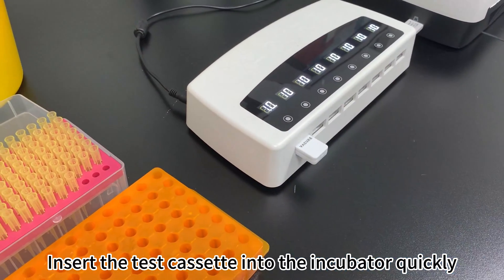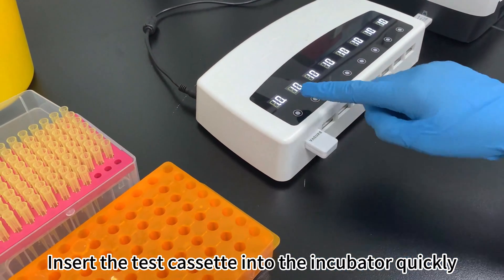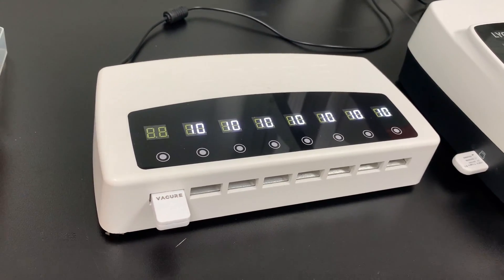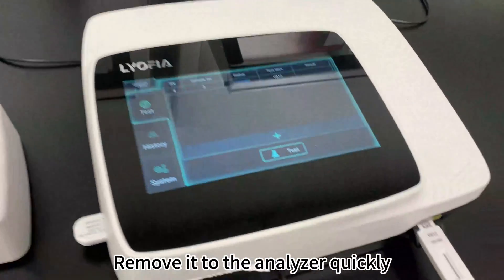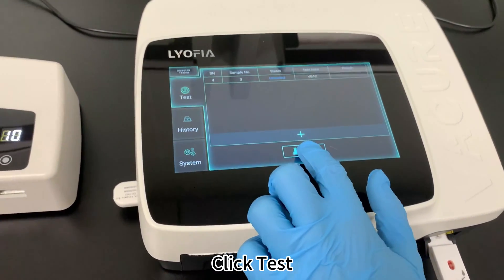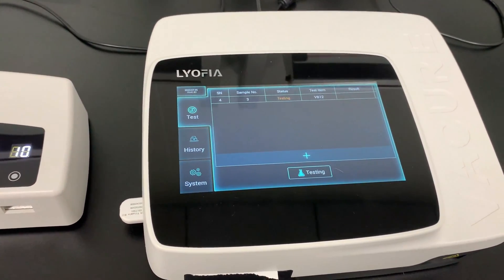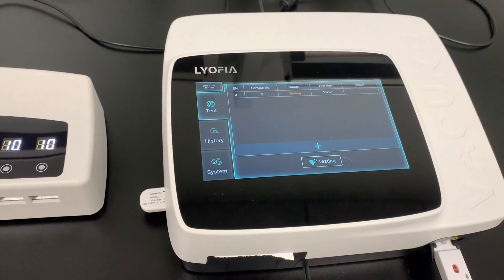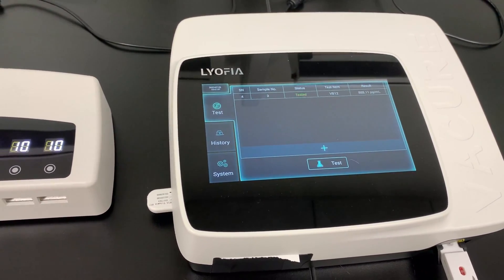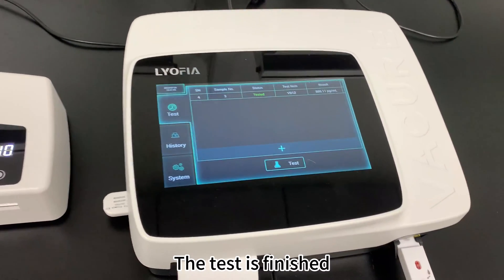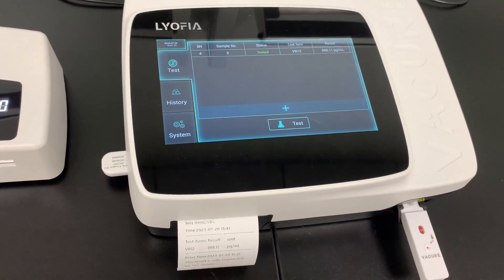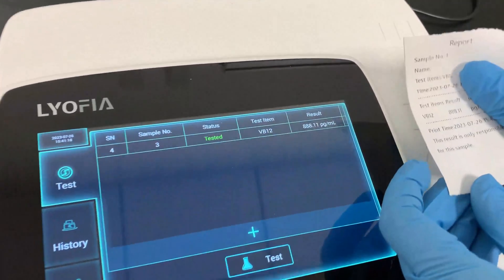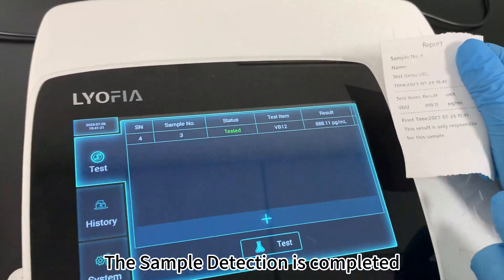Insert the test cassette into the incubator quickly. Remove it to the analyzer quickly. Click Test. The test is finished. The result is displayed on the screen and printed. The sample detection is completed.